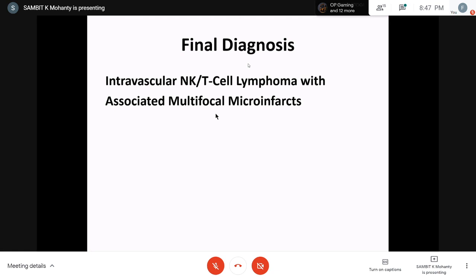Right, that's a very good question. Suppose you have a lung core, breast core, lymph node core, and especially a lymph node core. Tell your technicians to have at least 10 unstained polylysine coated slides ready for you when they are trimming the tissue. Because if they cut it the next day, they're going to trim and lose a lot of tissue. So you need like 11 sections up front, one for H&E, and the rest they keep expecting an immuno workup. And definitely, don't hesitate to ask for an opinion from your colleague.